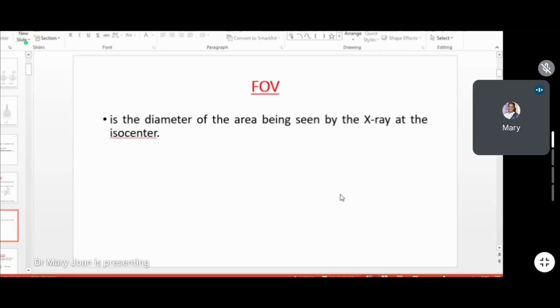So that is one axis, the center line or center point around which the X-ray tube rotates. Another axis is the collimator axis. Where we open the field of view, the collimator can also rotate, so the center point of that is another axis.